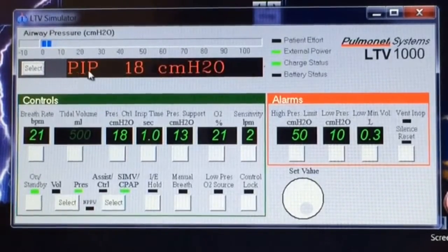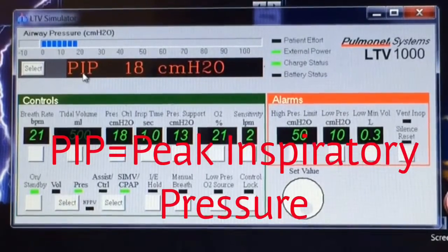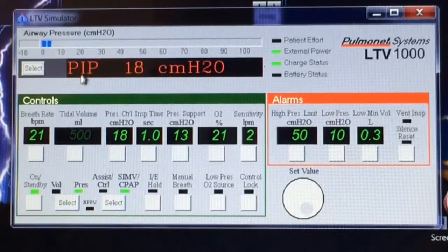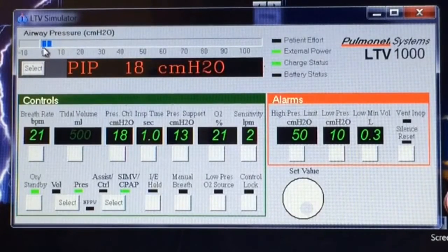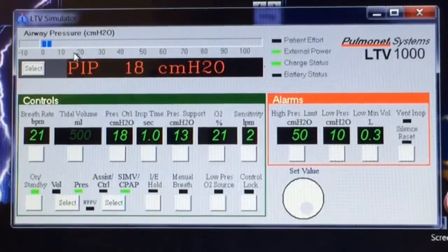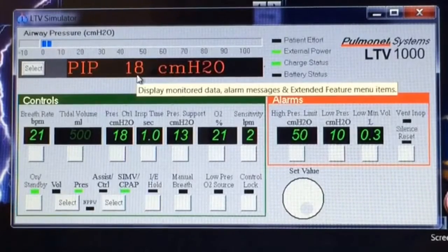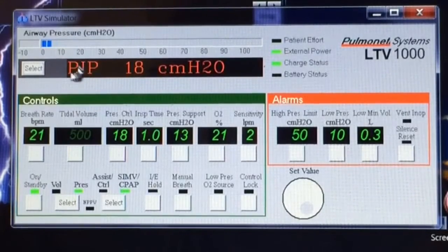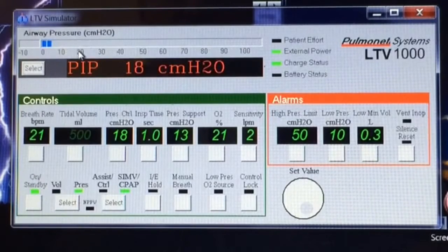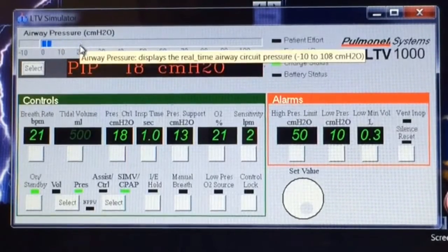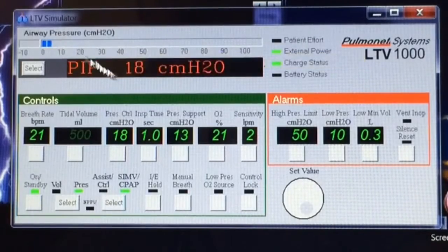The PIP is the peak inspiratory pressure — that's the highest pressure during the previous breath. As you can see up here on the pressure bar, it's giving a breath and it stops right here about 18. There is an internal option that when it gives the breath, it'll leave the LED light lit up at the highest pressure, so if you see that light stay on sometimes, that is why.